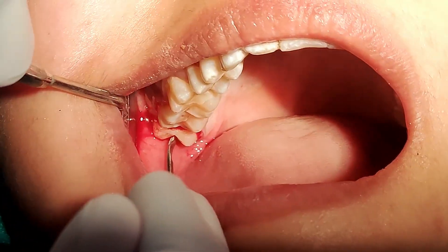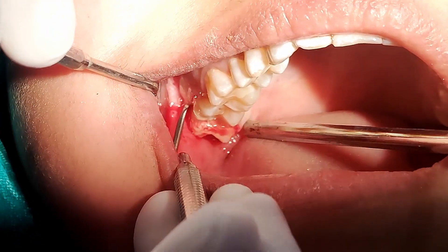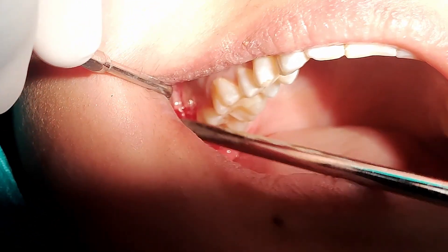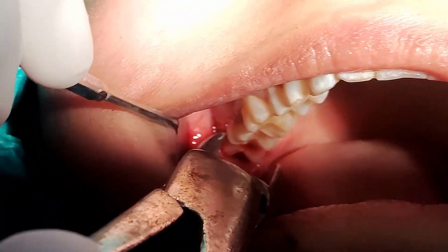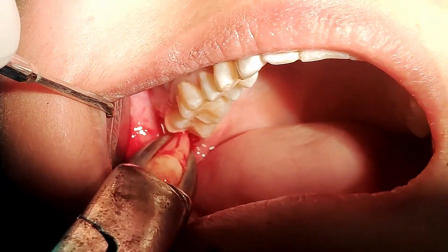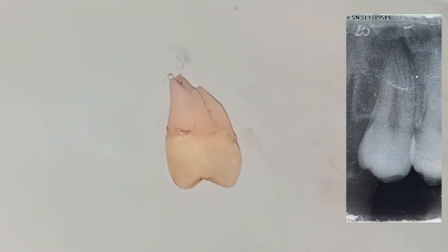You can see that the tooth is luxated and I just have to pick it out of the socket using a forceps. I am using a maxillary third molar forceps to deliver the tooth out of its socket. You can see the roots are conical as shown in the radiograph.